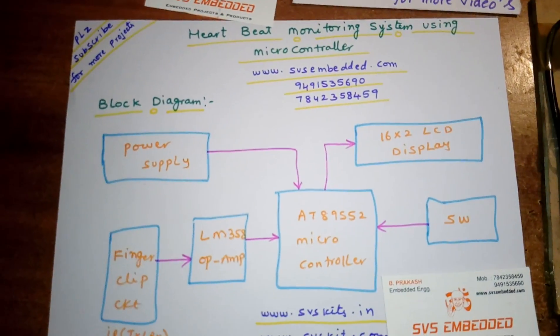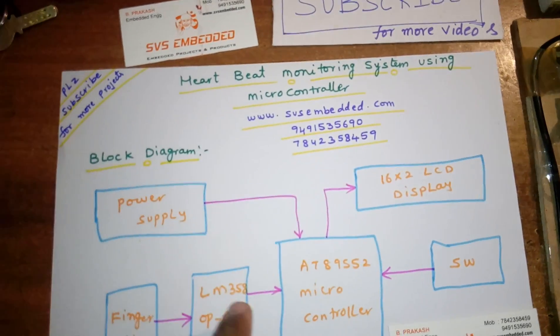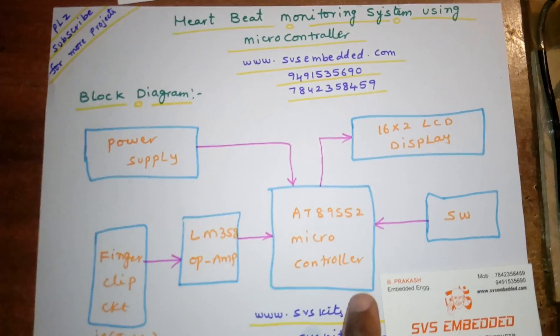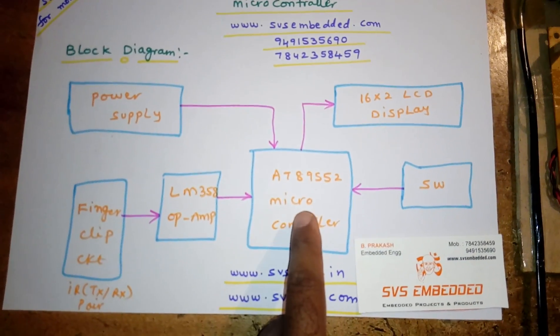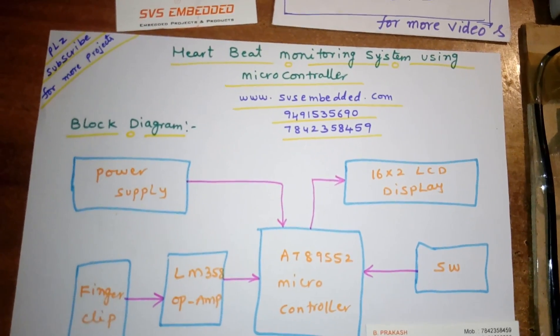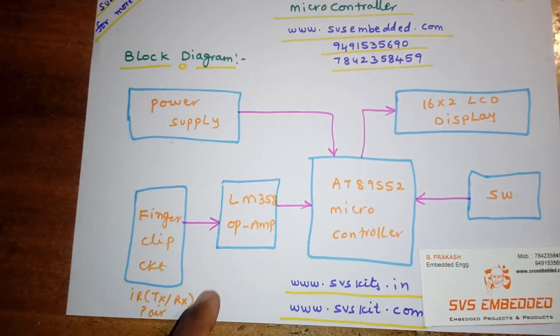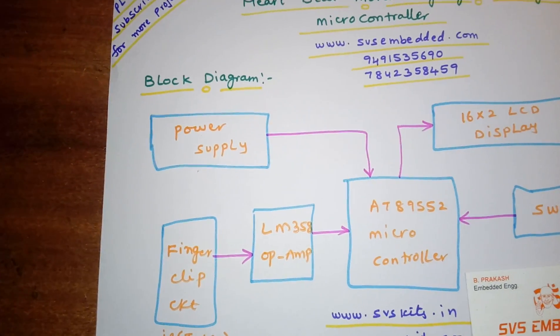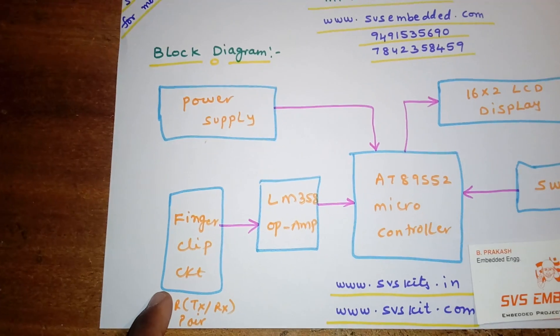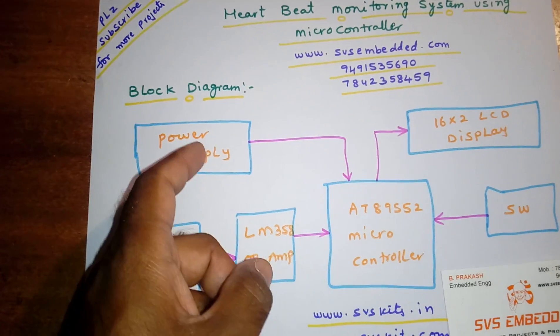Hi, we are from SVS Embedded. The project title is Heartbeat Monitoring System using 8051 Microcontroller. In this project I am using an AT89S52 microcontroller, an 8-bit microcontroller, a 16x2 LCD character display — whatever the process is going on will be displayed on the LCD. I am also using one LM358 operational amplifier, one finger clip sensor, and a transformer-based power supply.